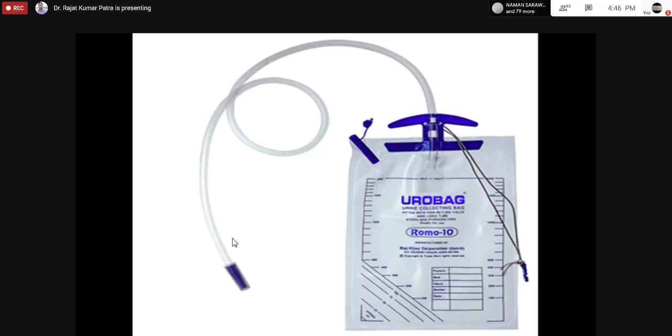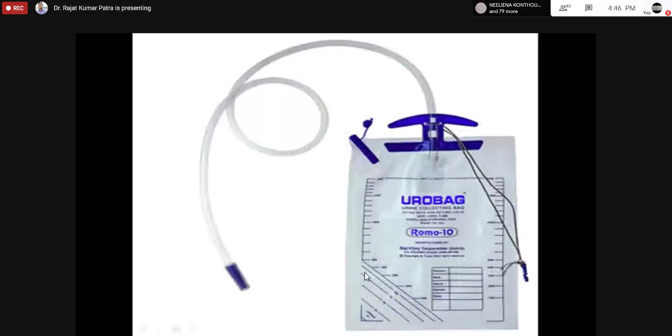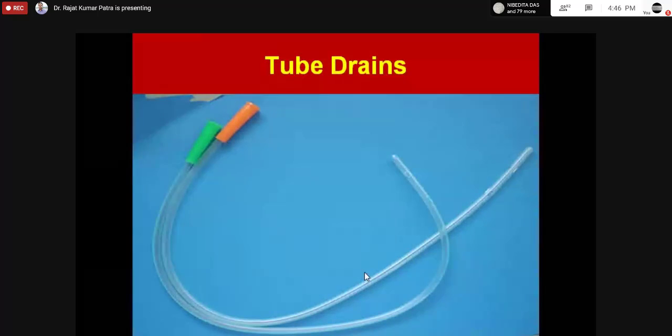Urobag. So this end is used in case of Foley's catheter. This is the open end you will use. To this open end the bag is attached. That is Foley's catheter. Then this is a tube drain.